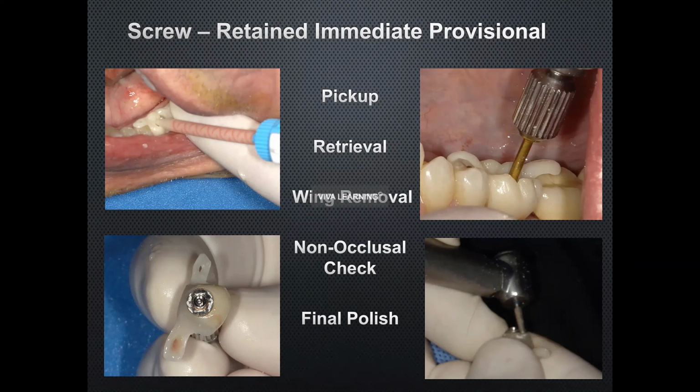And we're still, like I said earlier, that on-one is a wonderful abutment, or any kind of one-time abutment I think is great, because we're never going to disturb that implant abutment interface again. All of our work is going to be happening, in this case, 2.5 millimeters above that.